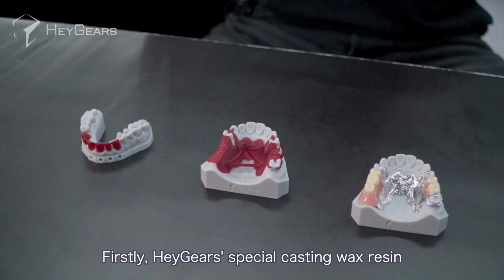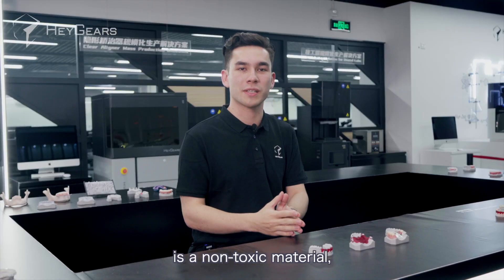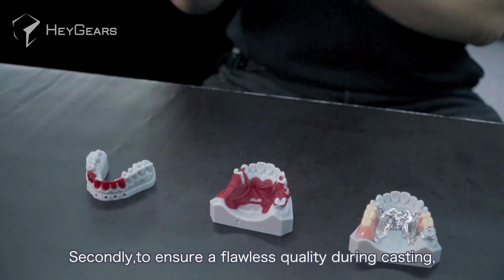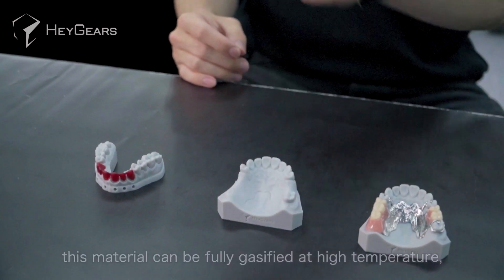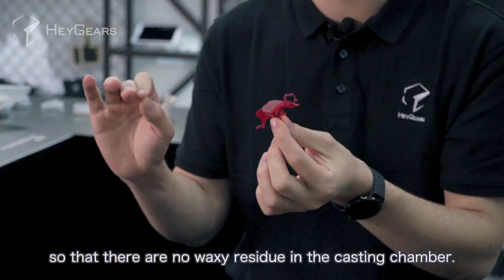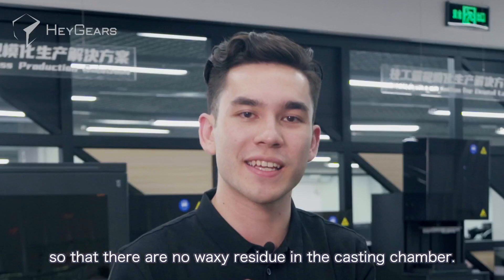Firstly, Heygear's special casting wax resin is a non-toxic material, ensuring absolute safety. Secondly, to ensure flawless quality during casting, this material can be fully gasified at high temperatures so that there are no waxy residues in the casting chamber.